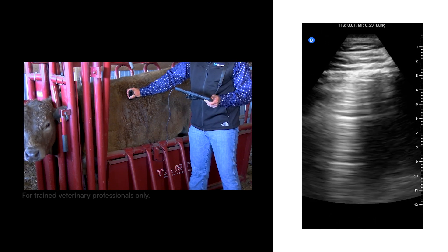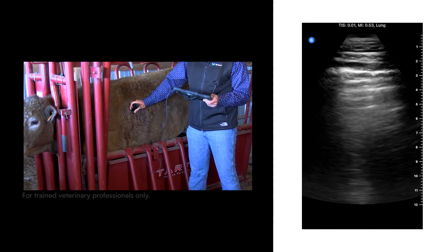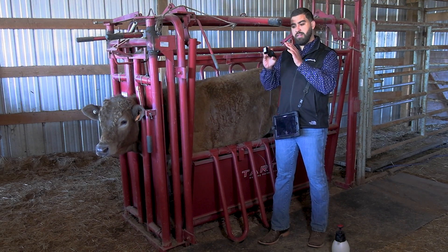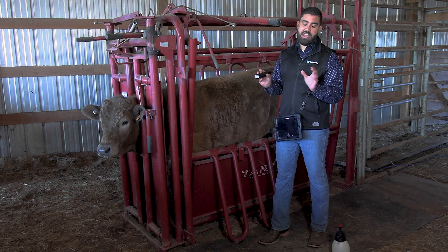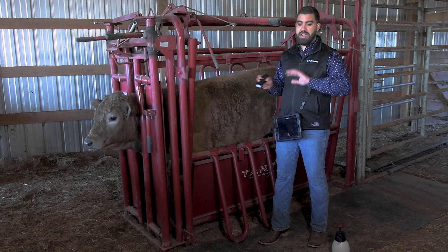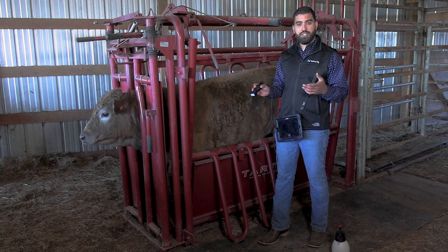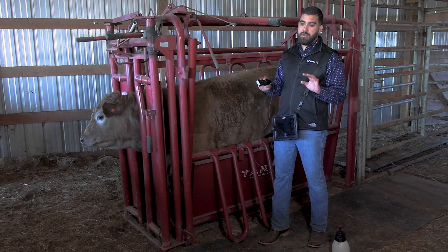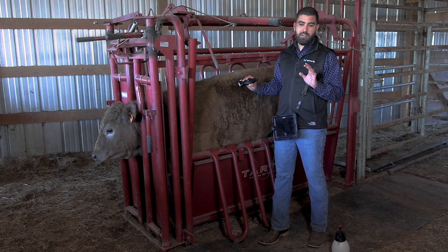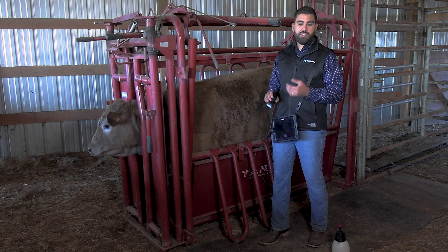The more you do this, the faster you get at identifying artifacts. You can score animals on a scale of one through five: one being healthy; two having thin and less frequent B lines; three having more B lines and merged B lines; four having a low degree of consolidation with B lines; and five being that the lung is totally consolidated, looking almost like liver tissue — which we call hepatization. When you get to score five, that area of the lung cannot recover no matter what you give the animal. It's very important to differentiate those scores because it gives you the ability to create a prognosis and a treatment protocol.